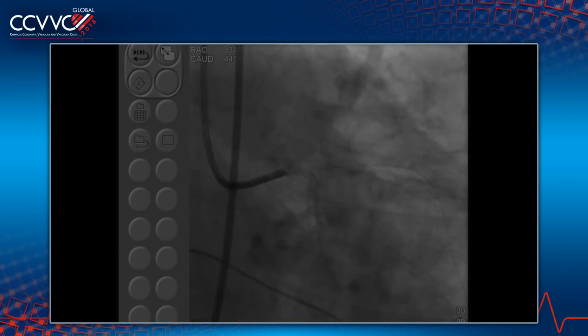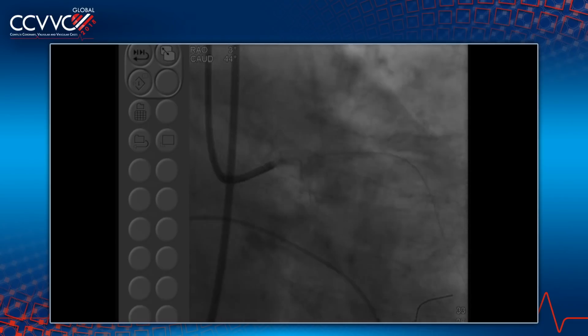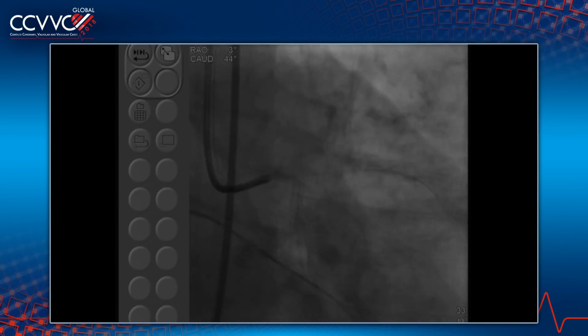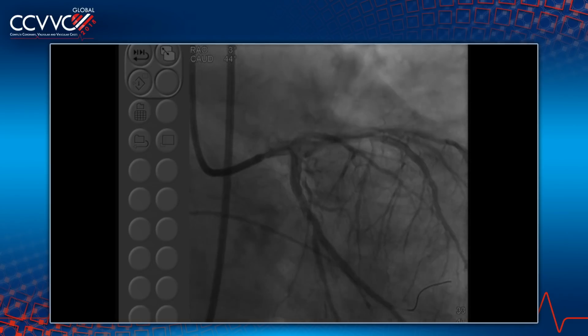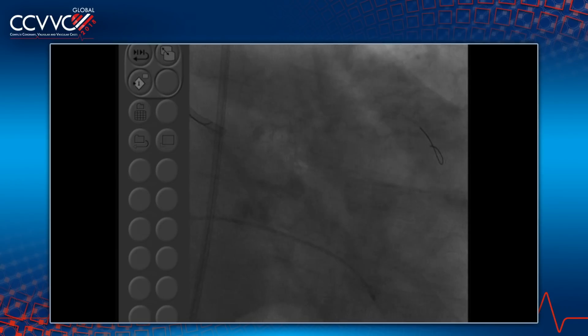Okay, so we're just showing this while Anu is getting ready in room 3 for another left main, and that makes everybody happy, and I'll tell you why, because there has been an access issue. Are you doing a TAVR now? Why not proceed with the TAVR right now?